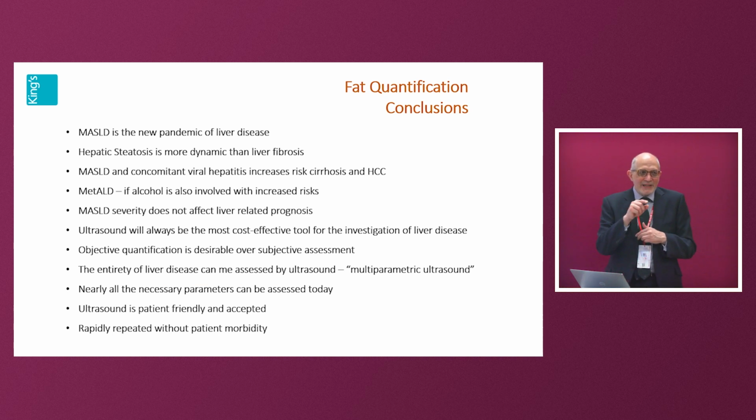Your patient comes in, sees you scanning them, and you tell them what the problem is. You tell them that they've got fatty liver disease. You tell them it's okay. If you find a focal liver lesion, I've given you contrast, it's a hemangioma, don't worry.